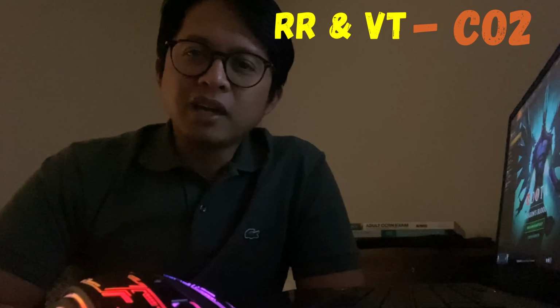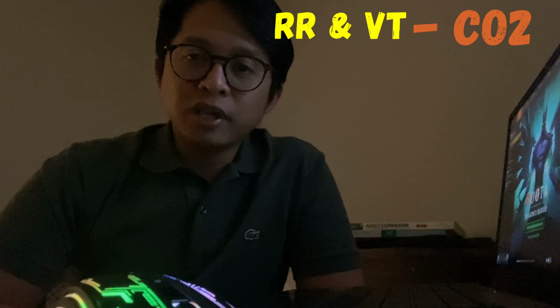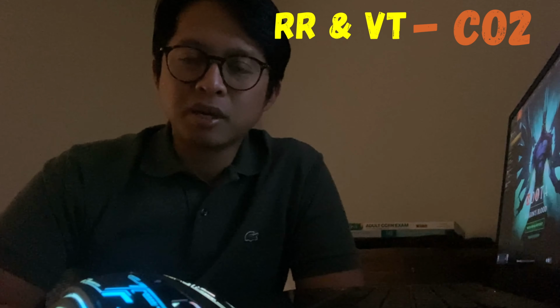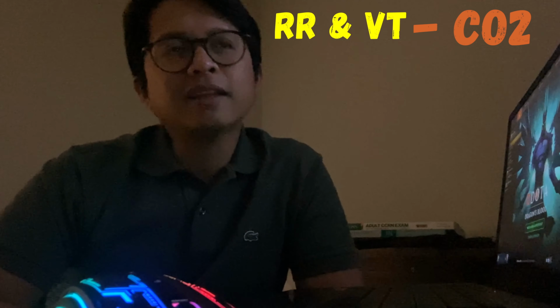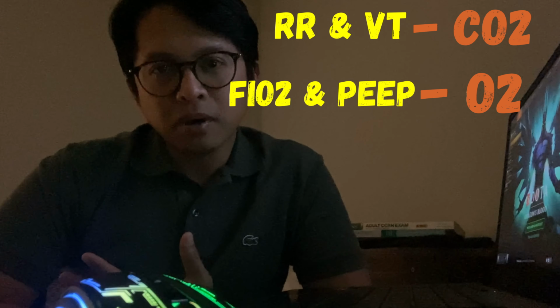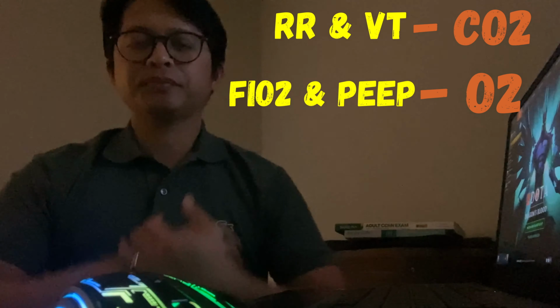Respiratory rate and tidal volume control the carbon dioxide. These are the settings we're adjusting to achieve the desired partial pressure of carbon dioxide. On the other hand, FiO2 and the PEEP are for oxygenation.